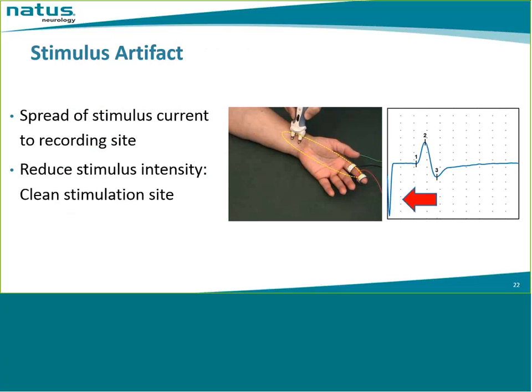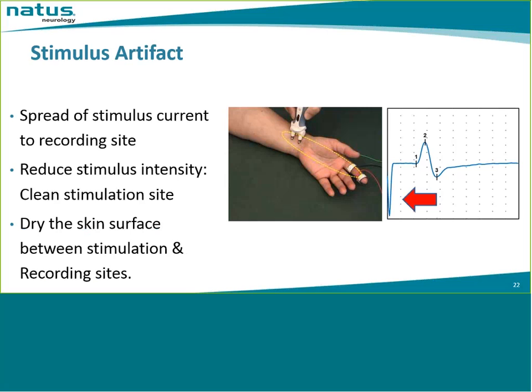Sometimes the patients will sweat, and the sweat along the skin surface provides a low impedance path between the stimulator and recording electrodes. So if you see sweaty palms, you may want to dry the skin surface to reduce this low impedance path.